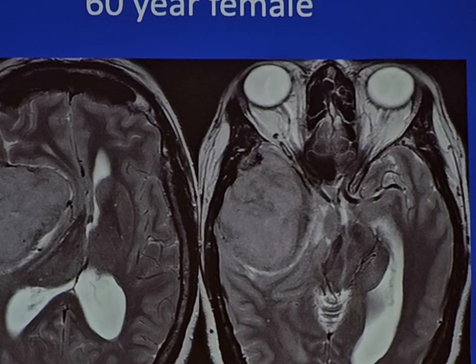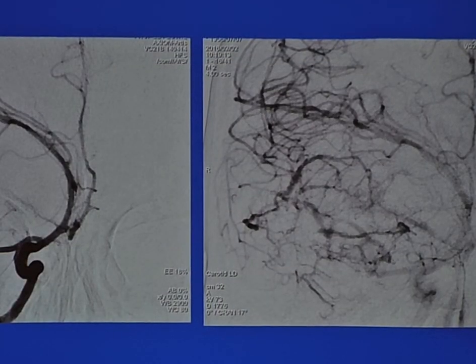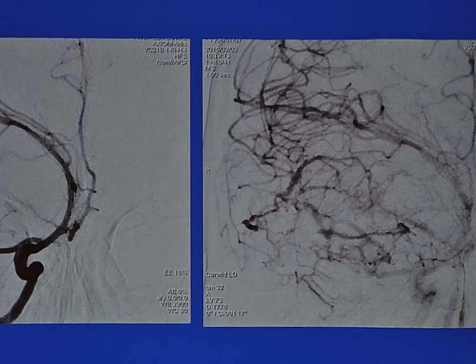Yes, to see the choroid first. I make a diagnostic angiogram. All right, yeah, good. Here's the angiogram. AP view, late phase. What's going on?